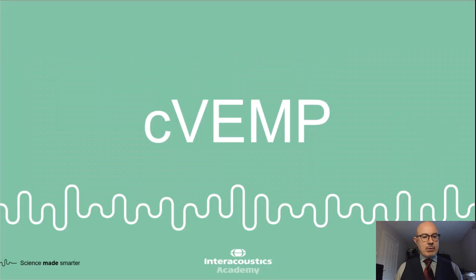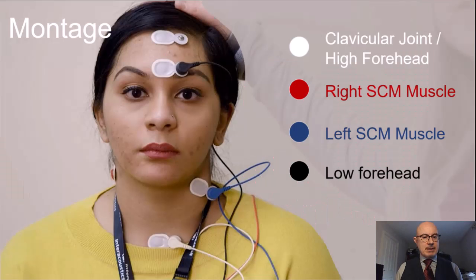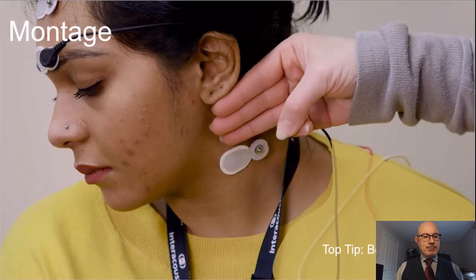So let's take a very quick look at the cVEMP montage. What you can see here is a recording from both the neck muscles, a ground on the lower forehead, and then a reference somewhere on the clavicle. Now you'll see in this example, for those of you with sharper eyes, the electrodes on the sternocleidomastoid muscle should really be relatively symmetric. In our example here, they're not quite where they would need to be. So we'd want to level those out so the right and the left are in better proportion.